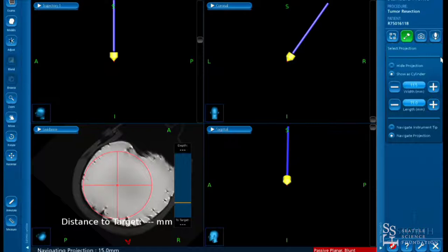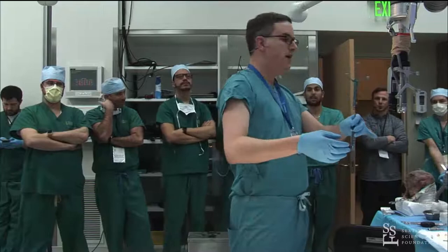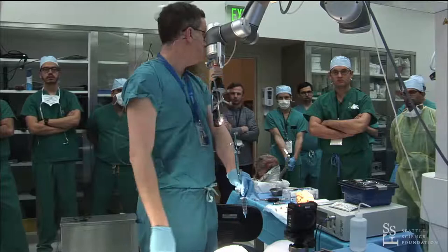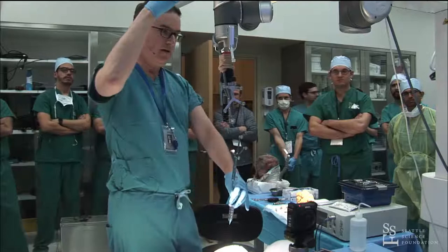If you're using an exoscope — whether it's the Synaptive system or the Storz system — you want to position the patient so that the trocar, once locked in place, is straight up and down. If you position the patient as you normally would, the trocar ends up at a comfortable angle but the exoscope ends up in your way. So adjust by about 20 degrees so the trocar and exoscope are straight up and down, and then you can work comfortably.